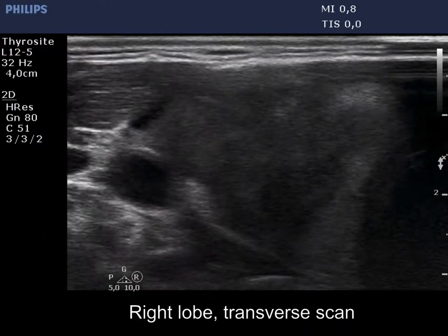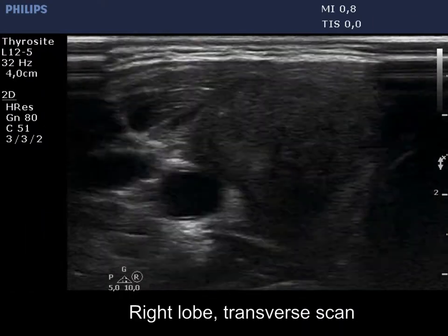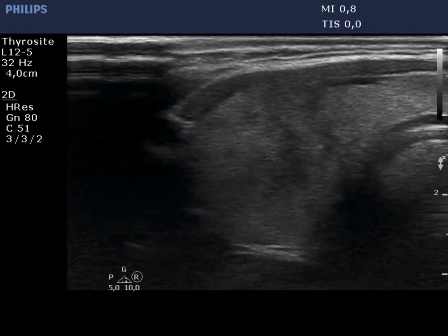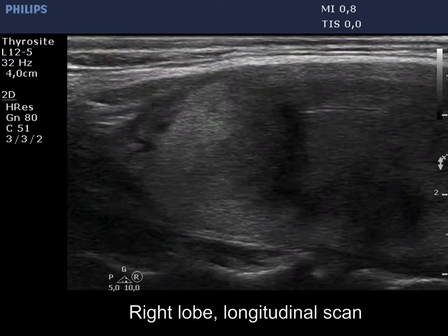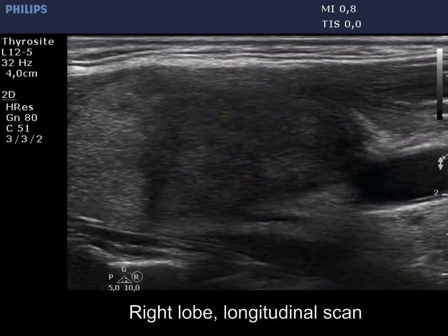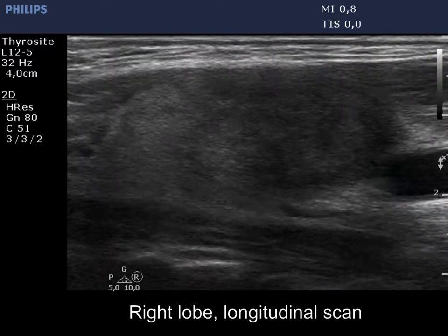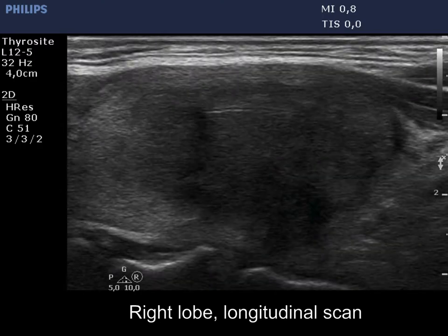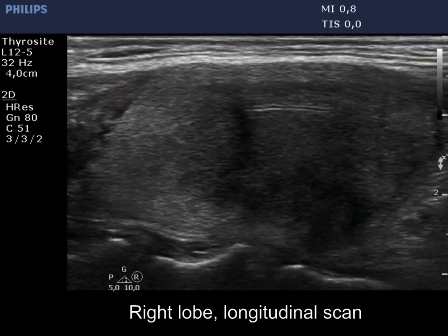The painful right lobe has multiple hypoechoic areas with ill-defined borders. The echogenicity index is around 70%. Note that the borders are blurred not only between the echonormal and inflamed parts, but within the inflamed area as well.